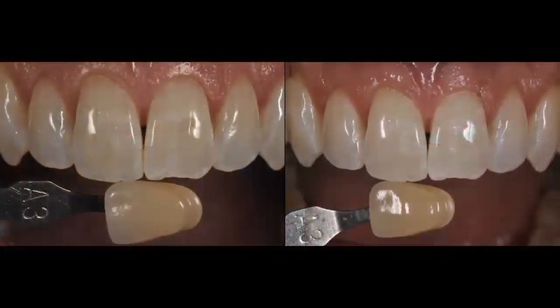But you at least want to wait 15 days if there's any other restorative work that you need to do on these anterior teeth, if you need to apply any composite or restore any teeth. Because you know that you have a lot of oxygen in these teeth right after the treatment, and you're going to have it there for some days after the treatment. That oxygen can actually inhibit the polymerization of any of your adhesive or resin composite. So that's the reason why you want to wait at least 2 weeks to initiate any restorative treatment if the patient were to need it. This is not the case of this patient.